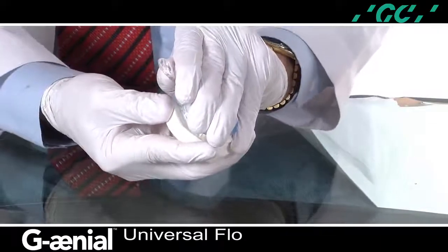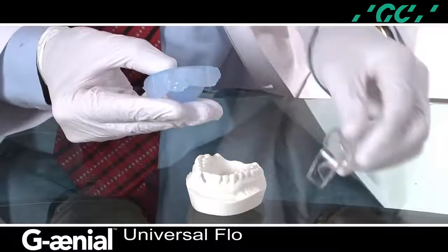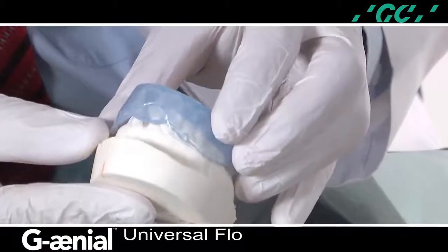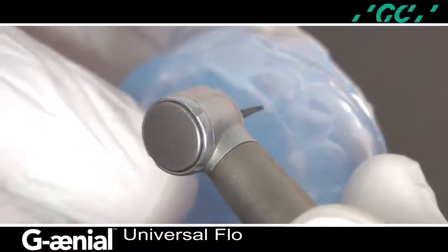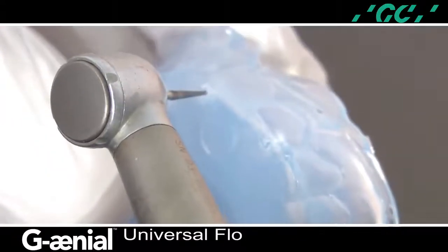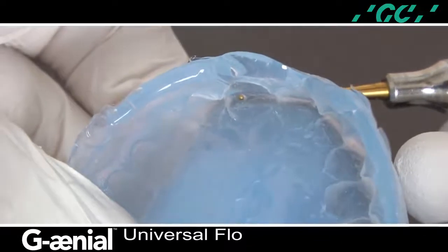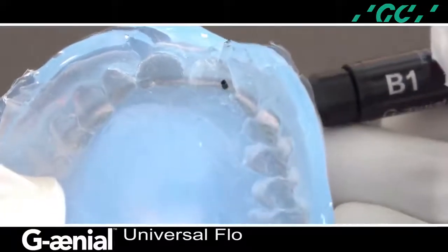Notice how easily the tray removes from the model — this was achieved by soaking the model in water. The silicone matrix is easily removed from the non-perforated tray. Trim the excess material from the periphery of the matrix and inspect it on the model. Small openings are created on the incisal facial edge of the central incisors with an 8-fluted needle-shaped finishing bur, an ET9 by Brassler. It is important to clean the internal surface of the impression and the orifices with an applicator tip to prevent silicone debris contamination of the composite material. The orifice should be inspected with a ball-tipped instrument to ensure a clear passage of the composite material, and remember to enlarge the orifice to the size of the syringe tip.